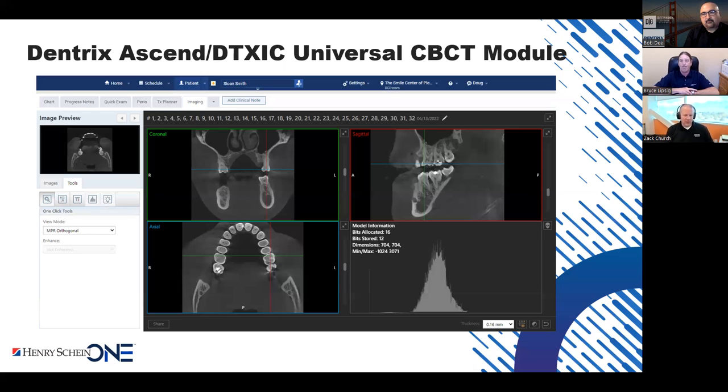Right. I wanted to add something that I didn't really touch on before, is that we're doing imaging the right way. Since our imaging product is used as a diagnostic tool, Bruce and his team are always well aware of the FDA guidelines that allow us to say this is a diagnostic tool.